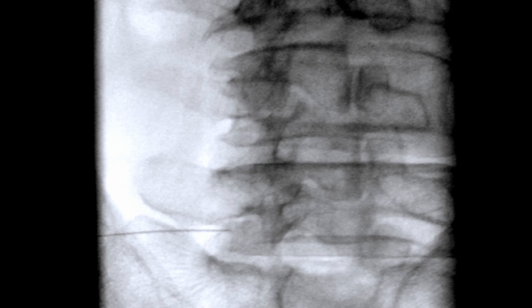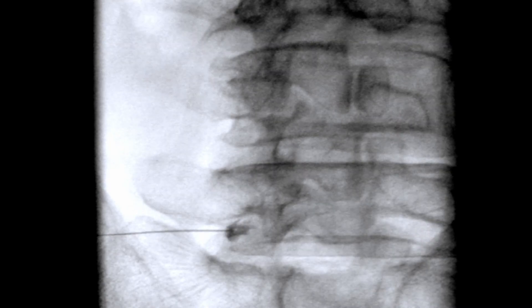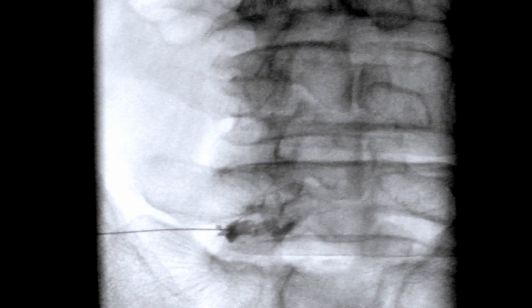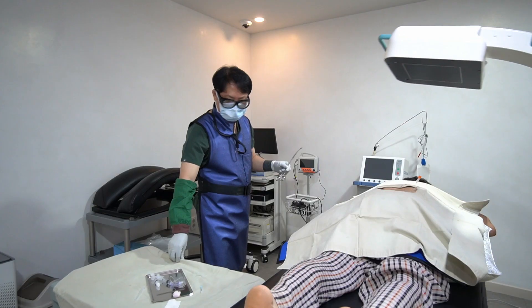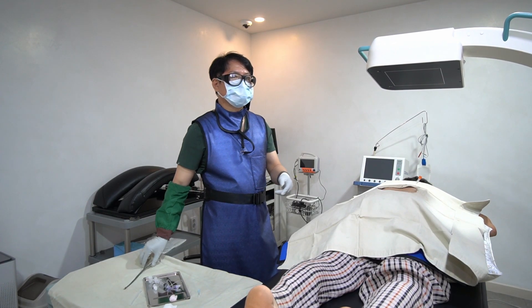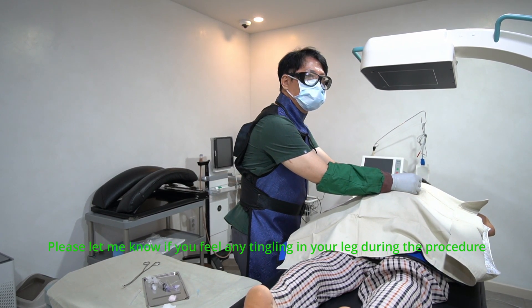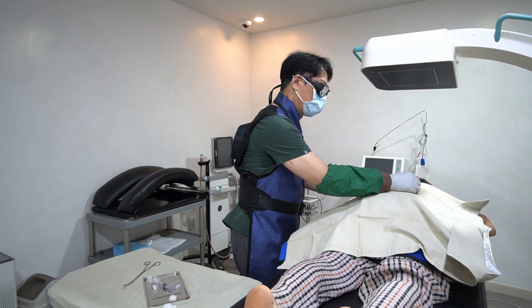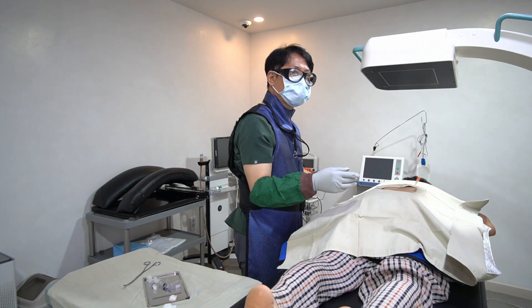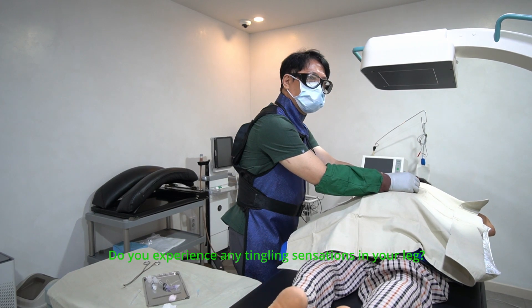When analyzing from both the AP and contralateral oblique perspectives, if pinpointing the perfect position proves challenging, envision an imaginary line connecting the needle's touchpoint and the nerve root's lateral boundary. Maintaining an open line of communication with the patient is essential to guiding the needle toward this recalibrated target. Such interactions underscore the significance of keeping the patient alert and involved.